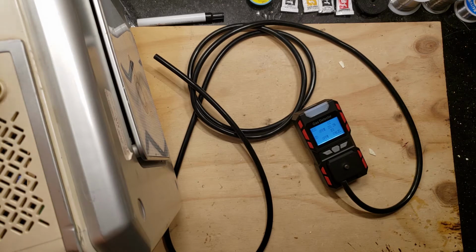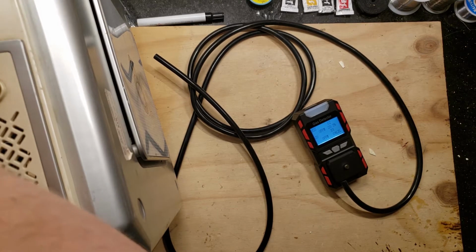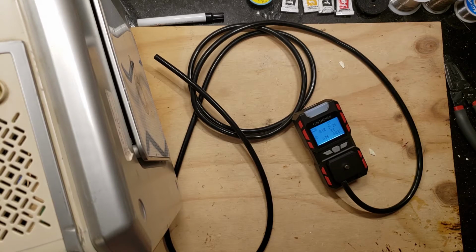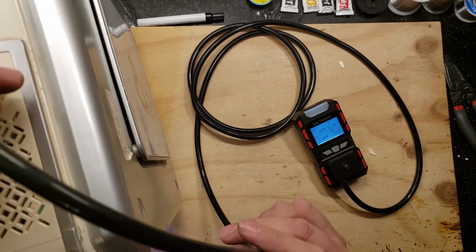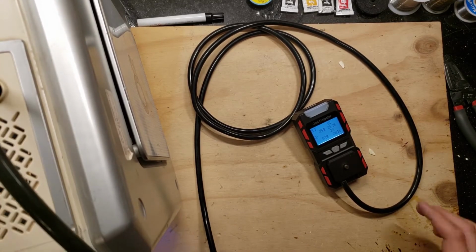So let's see if this will do anything. I'm gonna get the coin acceptor wire ready. Let's plug this in, and it's gonna start making some noise in a second. Okay. So there you go. Let's see what kind of oxygen we get coming out of this.